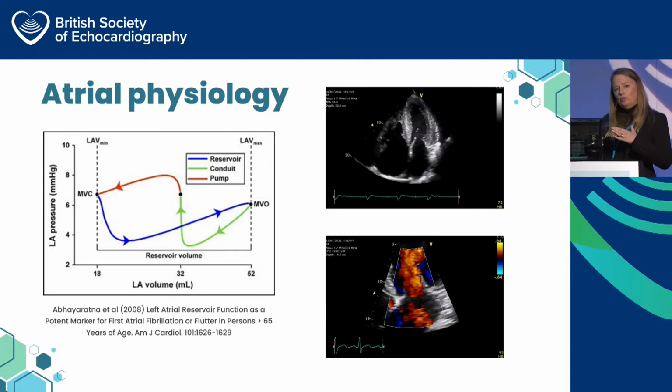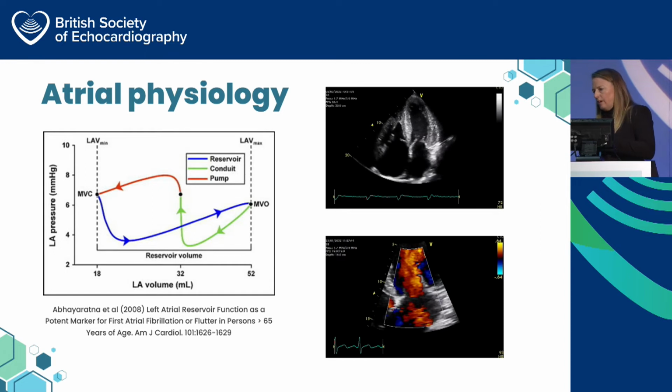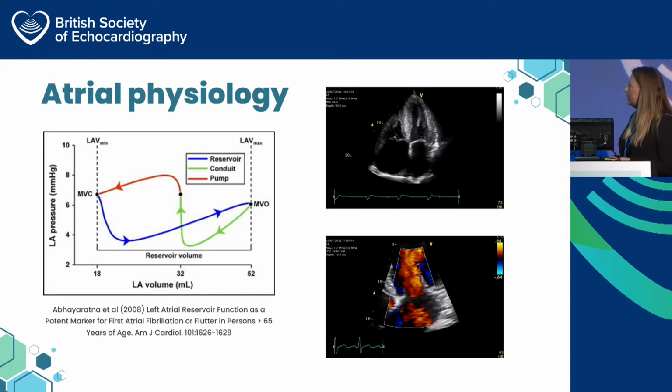Because although your mitral valve is closed in systole, think about what happens to your mitral valve annular plane. That mitral valve annular plane should move base to apex, and that helps reservoir function of the left atrium. So I think it's worth looking at that in a little bit more detail, and I've put the reference on the screen so that you can look at those different phases of atrial function if you want to.